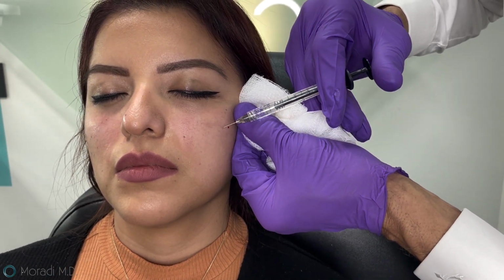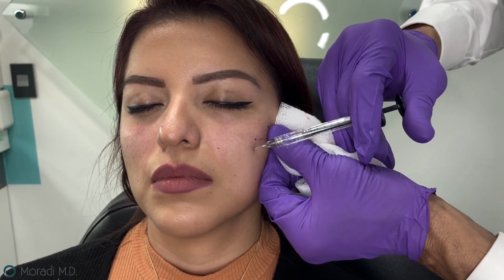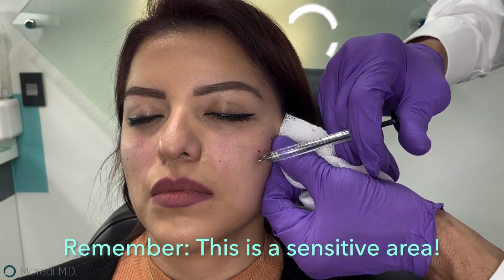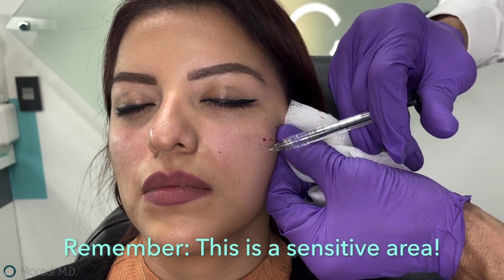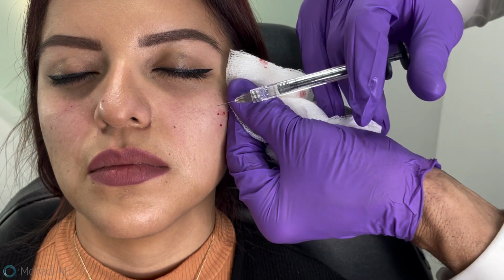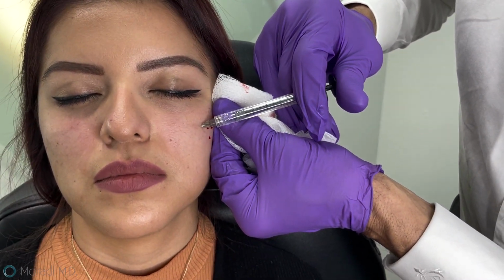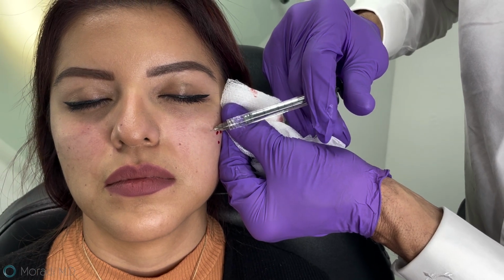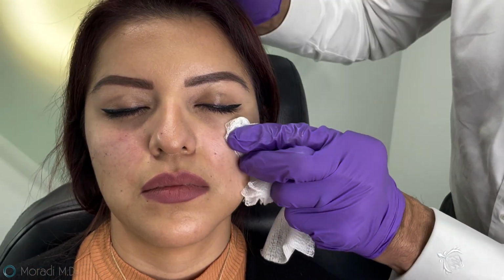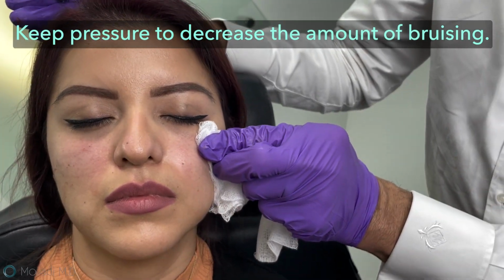Mild retrograde. Small amount, less than 0.1. Once again, this is a sensitive area. So I'm using the malar eminence in this case as my focal point. When you see any kind of bleeding, just keep pressure to decrease the amount of bruising.